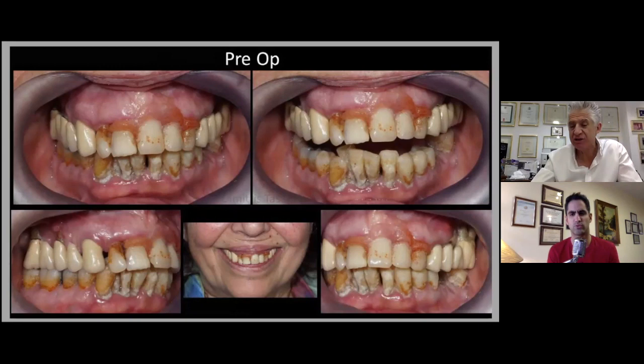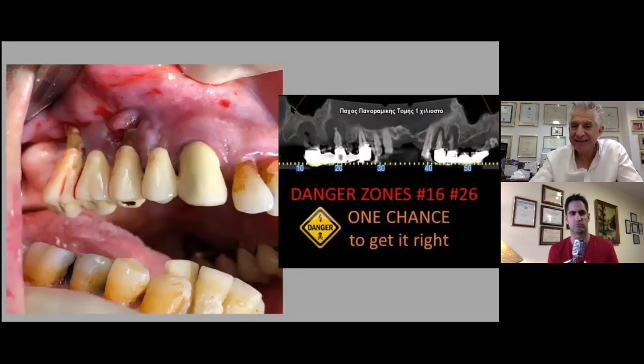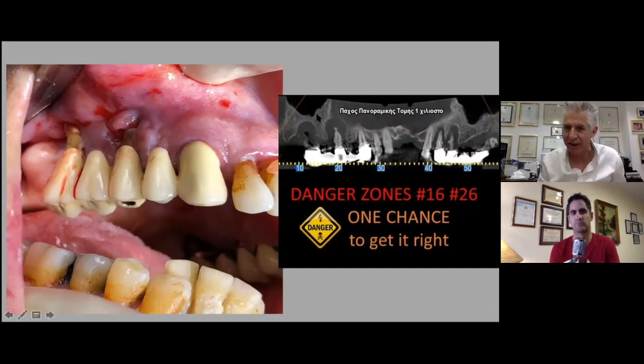And we have a few danger zones. Have a look at this area here, position number 16, danger zone. Why? Because we have a massive area of bone loss in front as well as behind. So we've only got a narrow island to work with. And with osseodensification, we have the ability to maximally use that bone, instead of removing that bone, use that bone, spread it, move it apically, laterally, condense it to get some good stability.